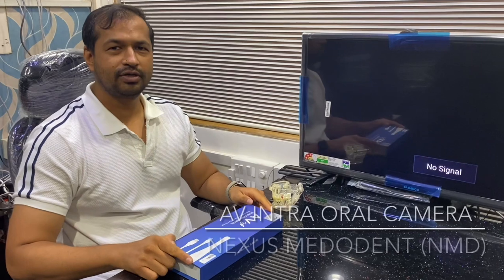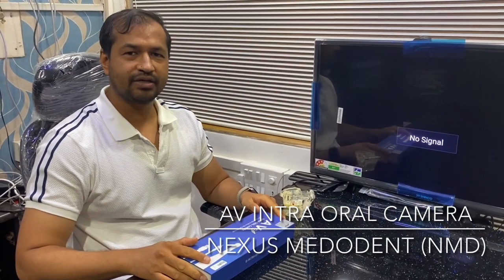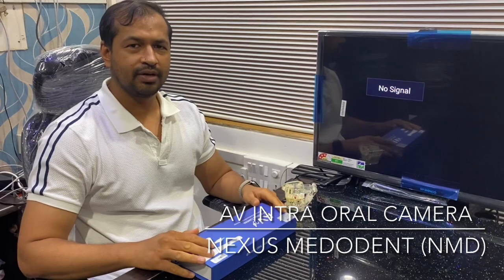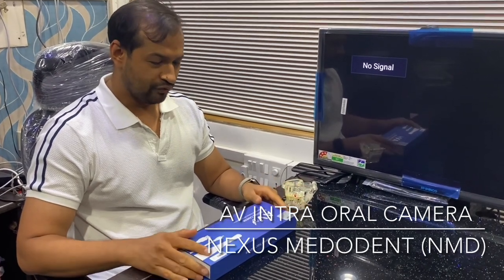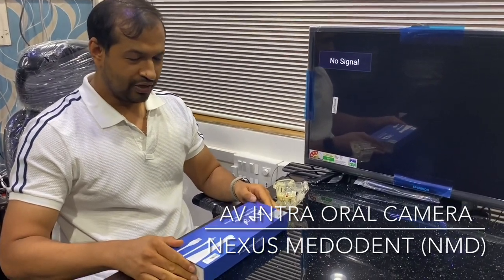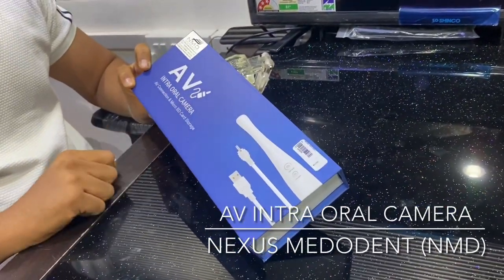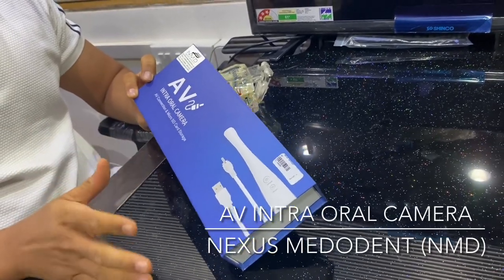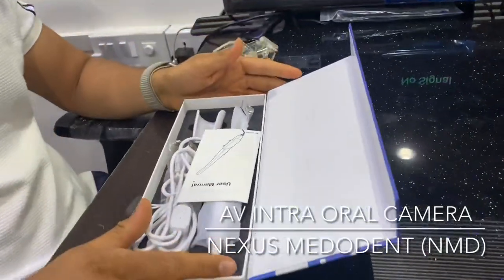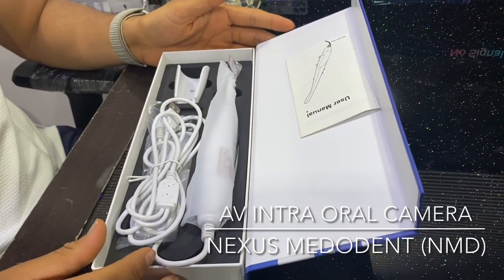We are back again at NMD — apologies that it's been a long gap, we've been tied up post-COVID with other developments. We have a lot of new products lined up and I promise we will be regular with our videos. Today we have a very interesting product: an intraoral camera with an AV output, meaning you can easily connect it to any of your TVs. The unique feature is that it's ultra high resolution.